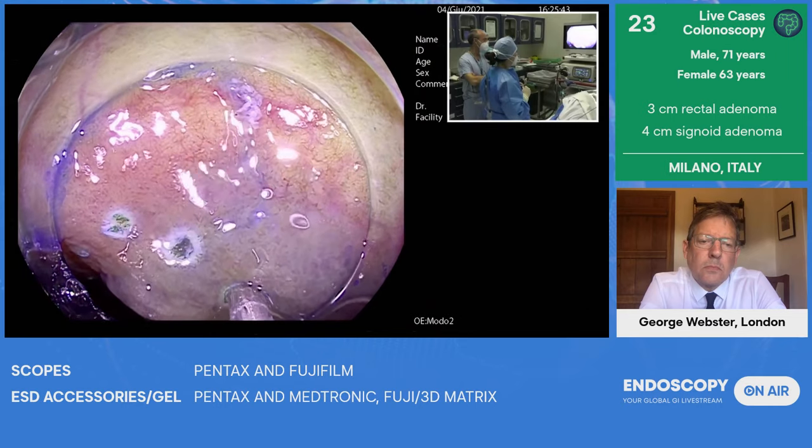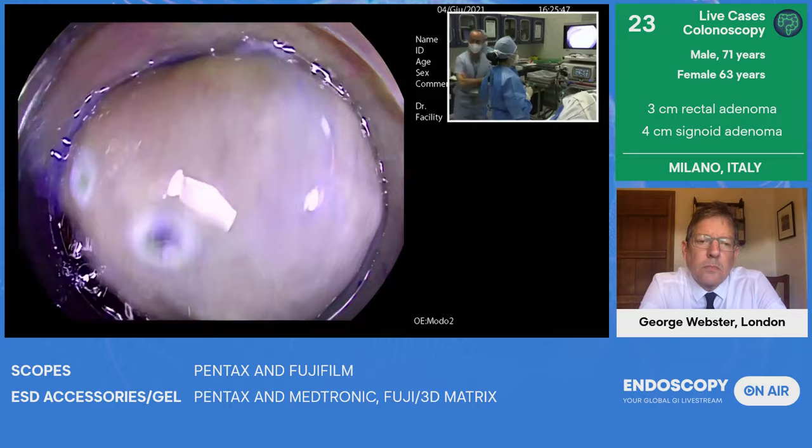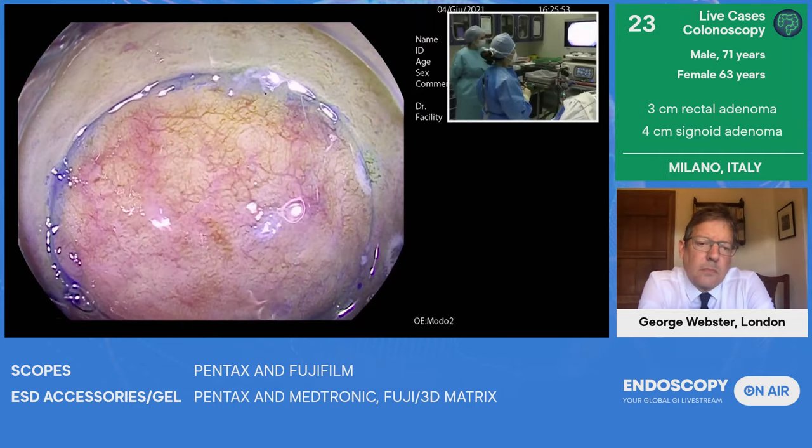So I leave you doing this resection. I try to prepare the next case. Okay. Because the lesion is not so big, I will inject just around all the lesion. Go.